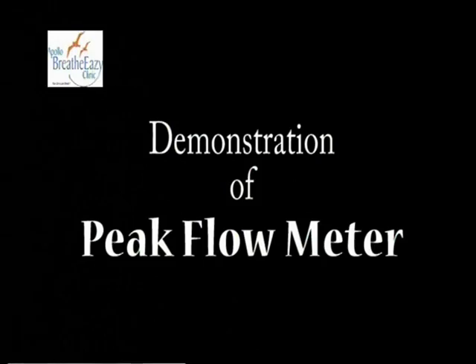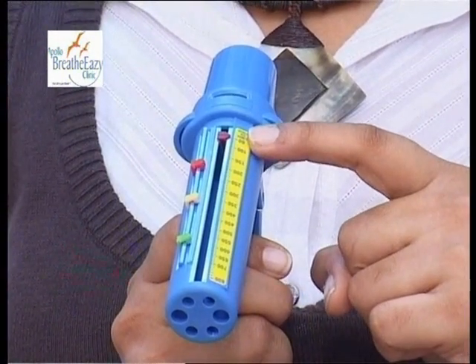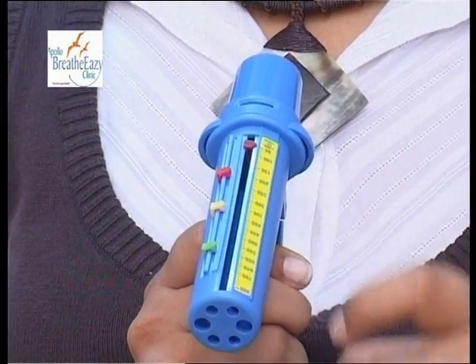The peak flow meter has its marker set to zero. The three zones — red, yellow, and green — tell you how bad or good your asthma is. Red means danger, yellow is caution, and green is go.